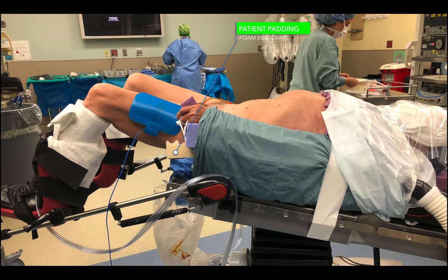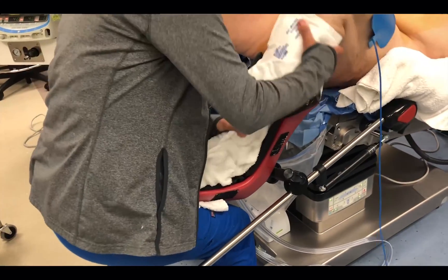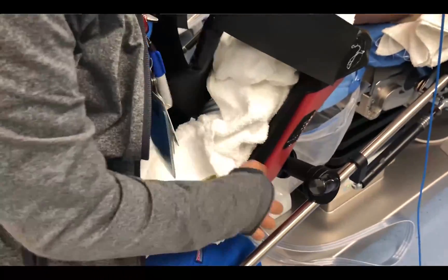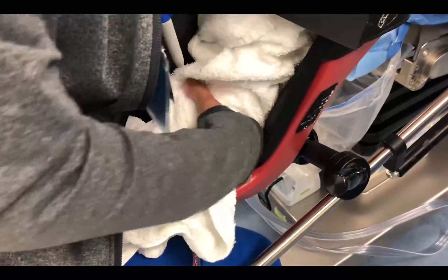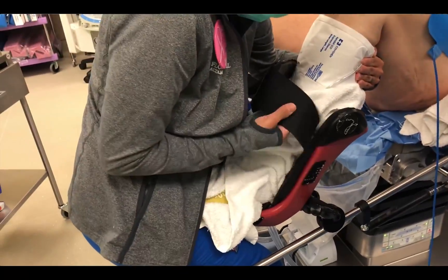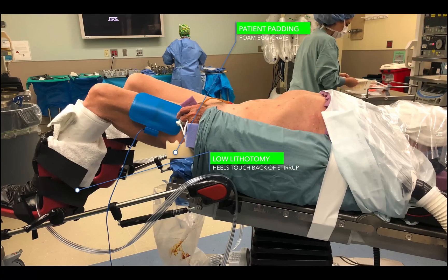I then place both legs in Allen stirrups. The most important thing here is to make sure that the patient's heels are touching the back of the stirrup. This offloads the calf and ensures that the posterior compartment of the leg doesn't have any undue pressure, which can lead to compartment syndrome. I place the legs at around 100 to 120 degrees of flexion, and I check the heels obsessively to make sure there is no undue tension. Once I'm happy, I fix the stirrups in place.